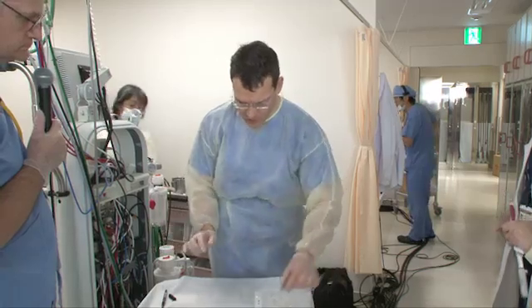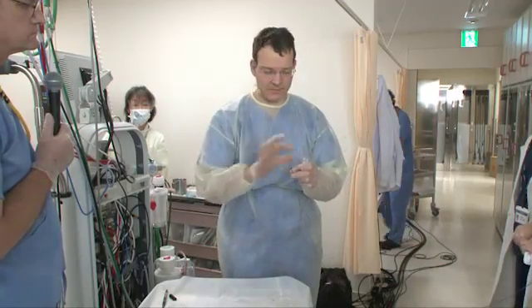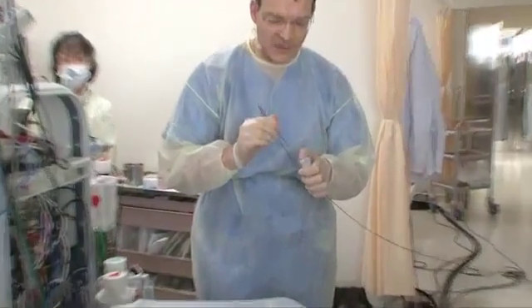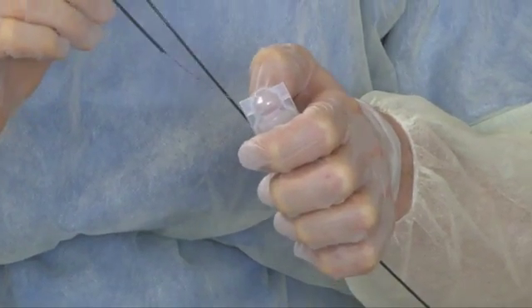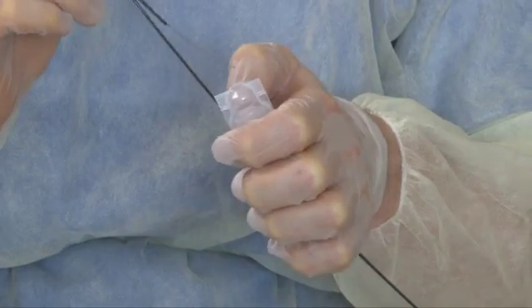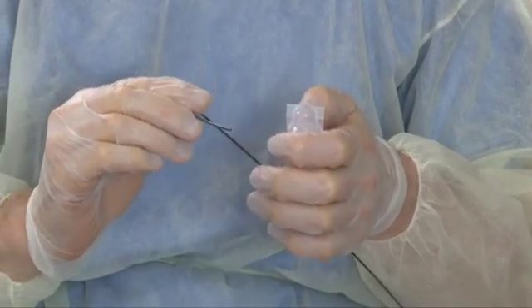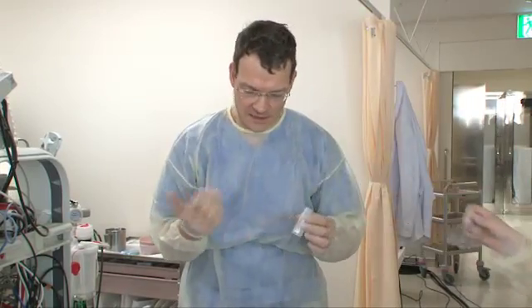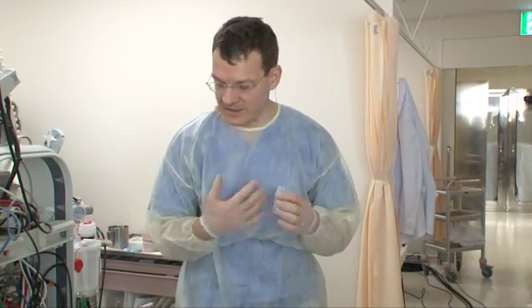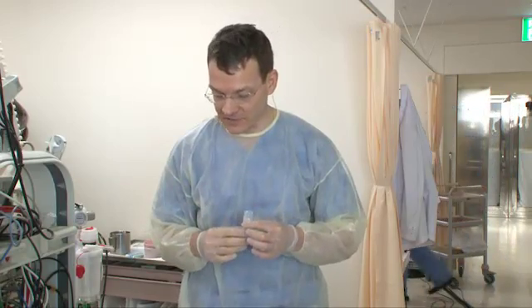And sometimes what I also do, give me the needle please, when I have the cytolit bottle, then I put the needle on the side and the nurse pushes the stylet inside, and then I also see if I have cells in the material we release, and then we shake, and then we have it in the fluid. Because we don't have the luxury of the on-site pathologist, this is a trick we do to confirm that we have material. But here I'm in front of the audience, and the pathologist will check immediately, but I'm relatively sure that we have material.